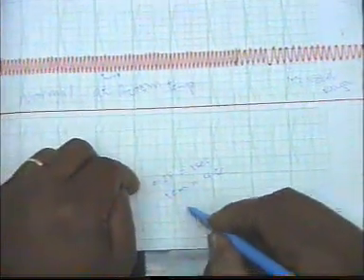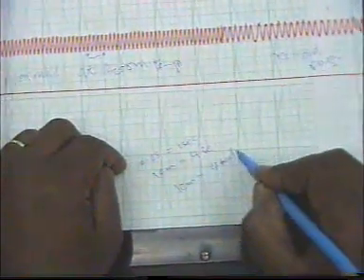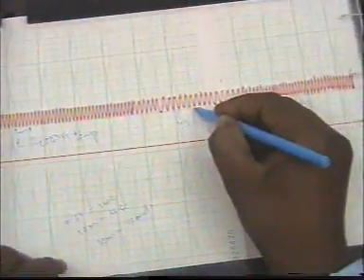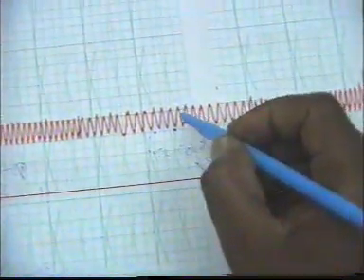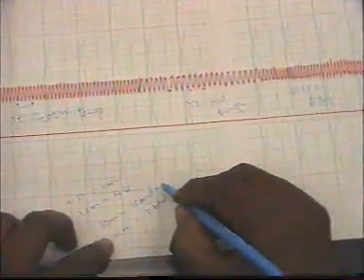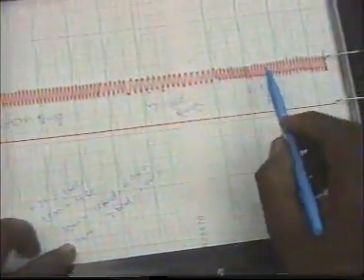In 1 centimeter we have 4 beats at room temperature. So when it's cold, from here, when you add the cold ringer, 1, 2, 3. We have only 3 beats in 1 centimeter, which is equivalent to 4 seconds.